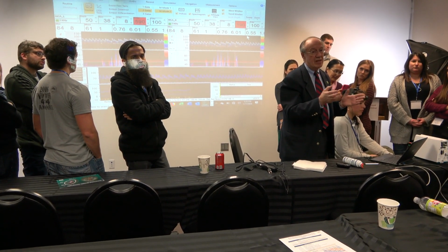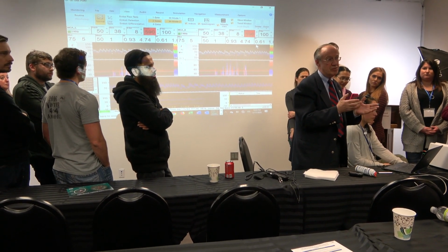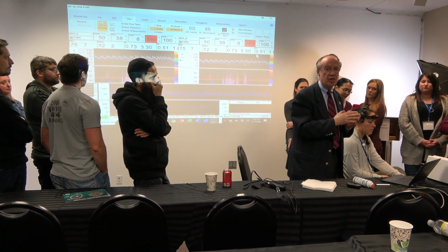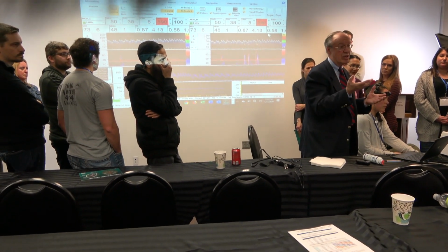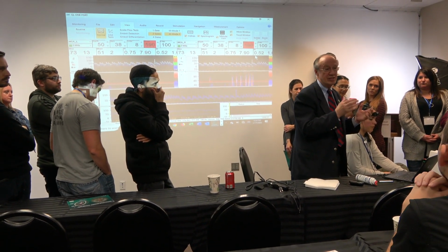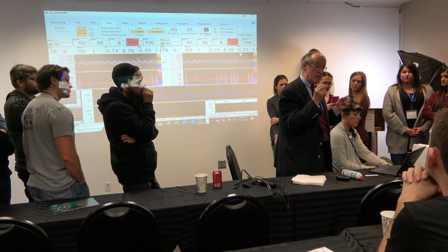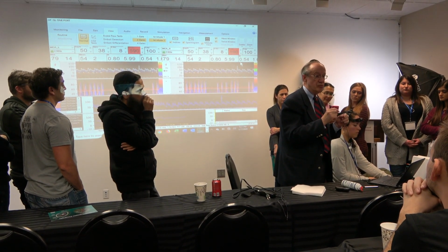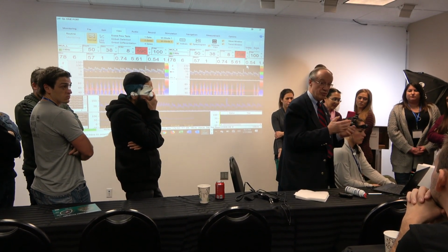I just remember you said something about looking at the basilar artery. Sure, you can do basilar artery too. Sometimes, if physician thinking about potential stroke, maybe stroke in posterior circulation, they can ask you, Alex, or so help, please monitor basilar artery for 30 minutes. And again, as I mentioned before, we have CPT code for emboli monitoring, but not in OR.